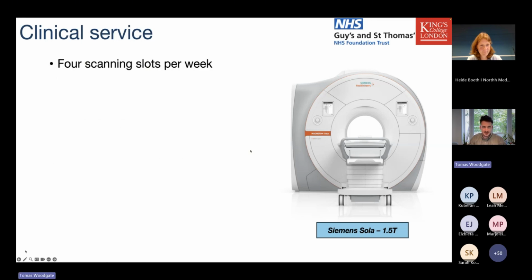We scan about 4 patients a week, or we have 4 slots. We try to limit our scans to about 1 hour in duration, but our slots are quite a bit longer than that so that we don't have to rush too much. The slots are about 2 hours long, which gives us enough time to get the patients on the scanner and comfortable, site the Doppler device, allow the patient to have a break if necessary, and deal with any time delays that happen in clinical practice.